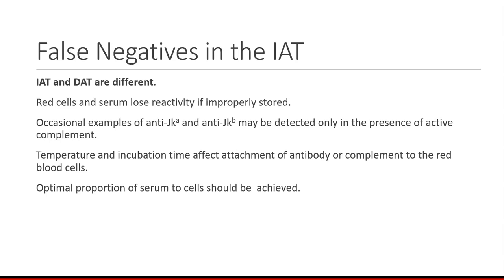In every area of the laboratory, procedures must be followed, and that includes the transfusion service. And my students would get really upset with me because I would be behind them, and I'm watching, you didn't do this or you didn't do that. Keep a ruler or a sharp edge, a sheet of paper, and put it under each step that you're working on. And then once you complete that step, move it to the next step. Because the most common problems or issues with students is because they didn't follow the procedure exactly.